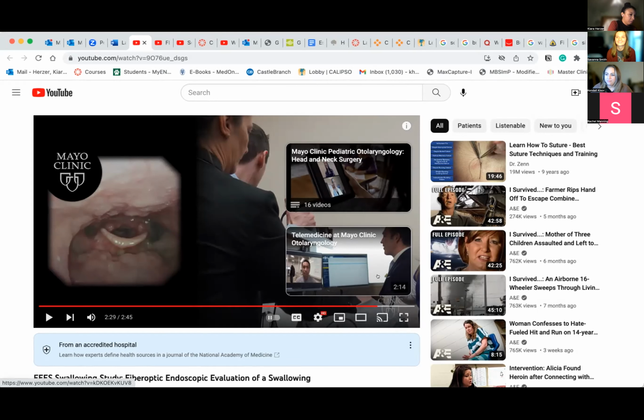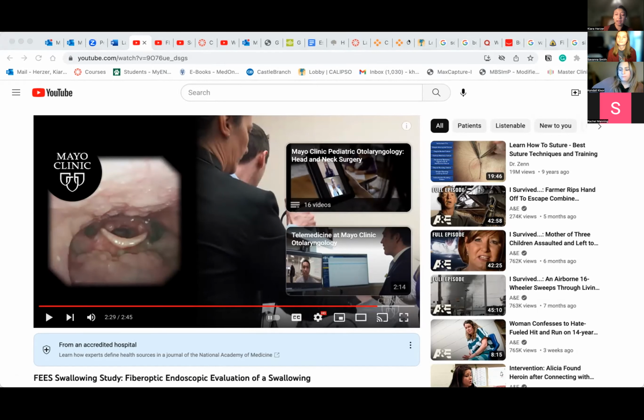So the reason it looks so bumpy is because what you're looking at are called the vallate papillae, which contain our taste buds. Enlarged vallate papillae are usually not a sign of concern and can be caused by allergies or irritations from certain foods or chemicals.